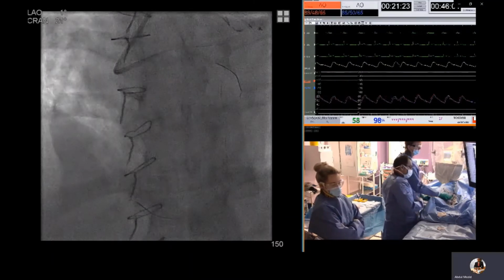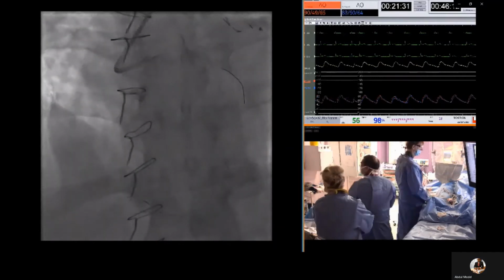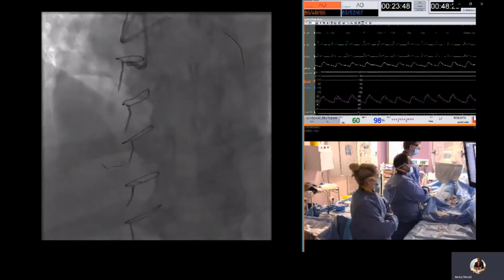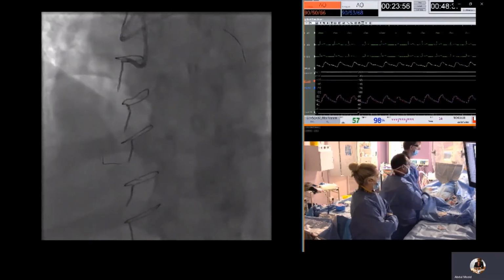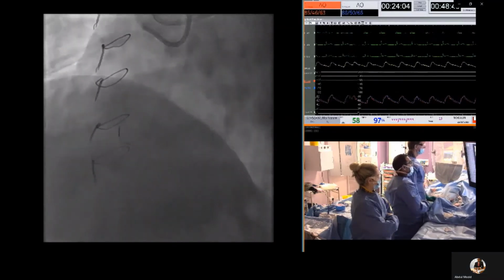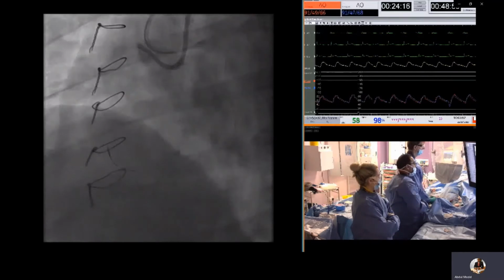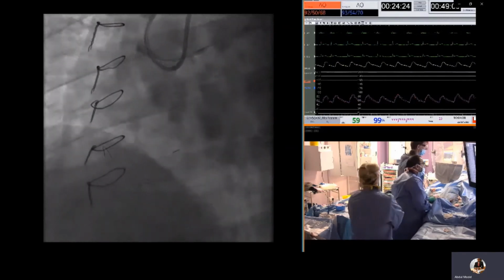And at the distal bifurcation, we then took a Pilot 200 wire to puncture the cap and to form a knuckle. So we now go on to advance the knuckle, followed by the microcatheter. Withdraw the wire back into the microcatheter and push again. And we can see here that the size of the knuckle is large, giving us an indication of the size of the vessel, which is at least a 4 millimeter vessel by the size of this knuckle.